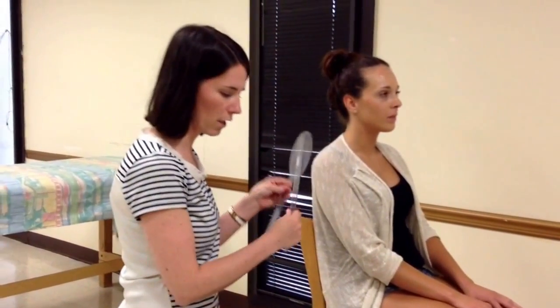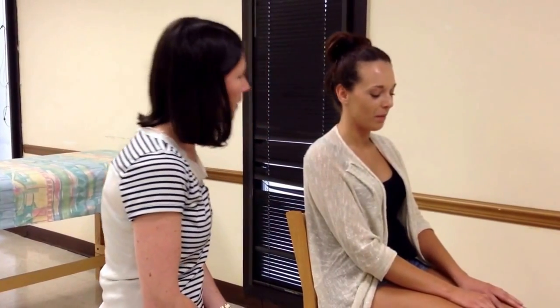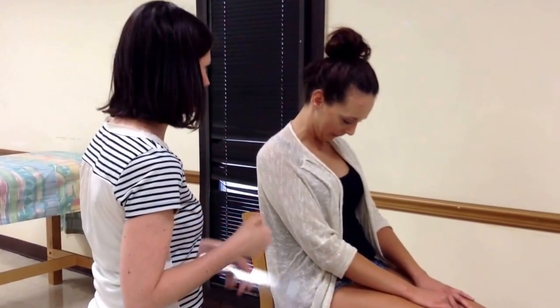I need to be next to the patient so I can use my goniometer in the right plane. We're going to do cervical flexion first, and the normal value for that is 0 to 50 degrees. The instructions to give the patient are to bring your chin to your chest, so I'm going to have her bring her chin all the way down to her chest.